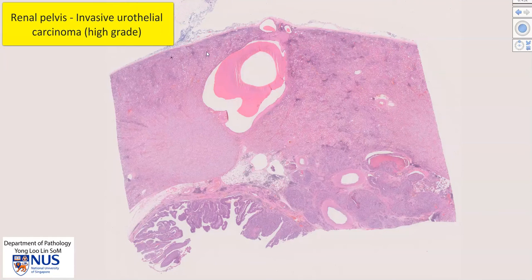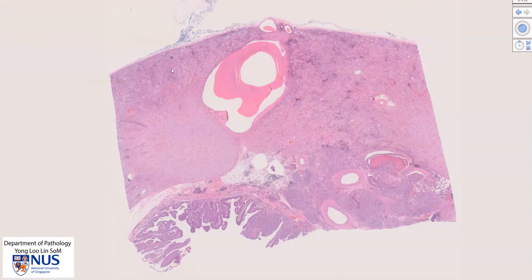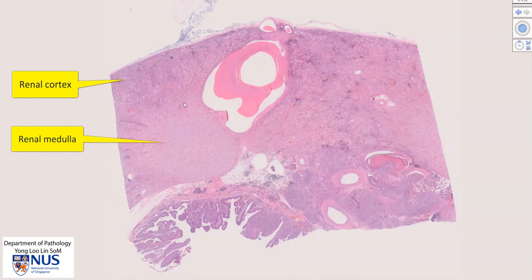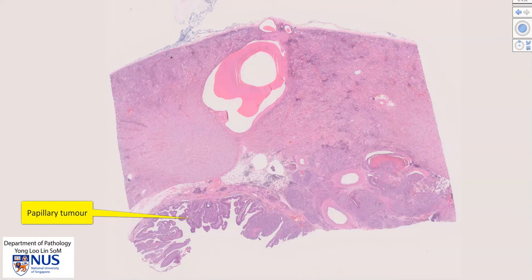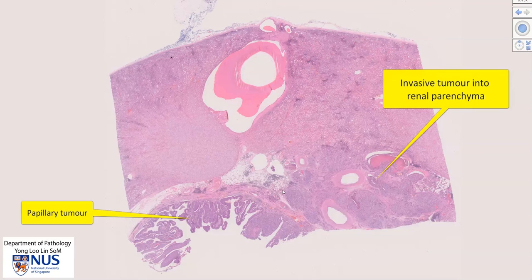Here we have a section of the kidney. This is the region of the renal cortex, here is the capsule of the kidney, this is one of the pyramids in the renal medulla, and this is the renal sinus fat. This region is the renal pelvis, which is lined usually by urothelium. Here is a papillary tumor within the renal pelvis, and in this area we have an invasive tumor that is invading into the renal sinus fat as well as into the renal parenchyma itself.